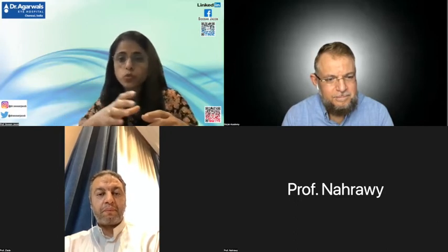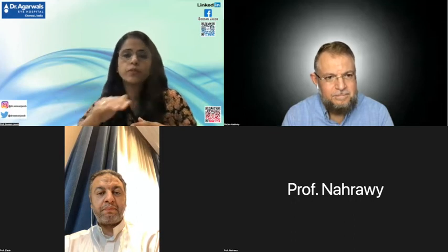And at the same time, because sometimes you do put larger segments, you do have some amount of arc shortening as well. And I think the third mechanism that it acts by is also epithelial remodeling. So because it's more superficial, you get more epithelial remodeling than you would with an Intacs or a synthetic segment. So I think these are the three mechanisms that it acts by.